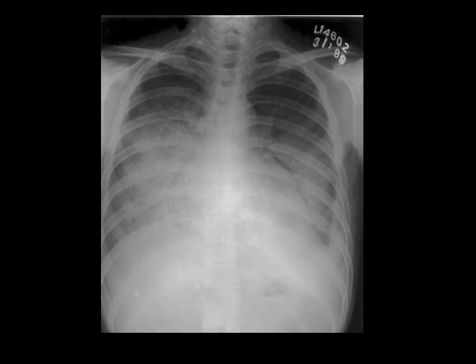Coming to the next spotter, you can see the classical batwing appearance. This is a case of pulmonary edema.